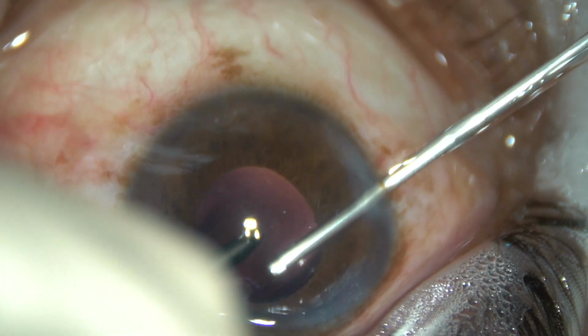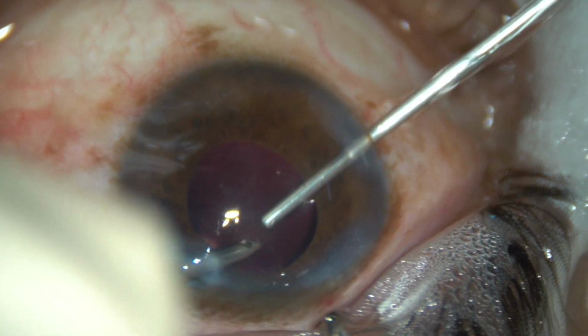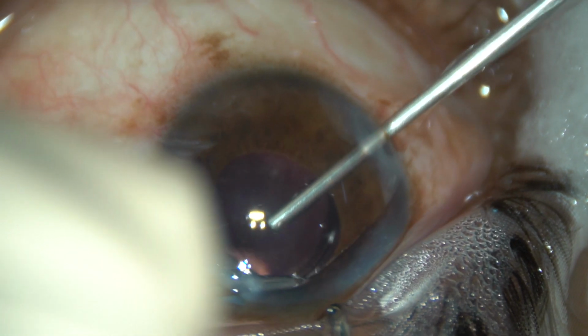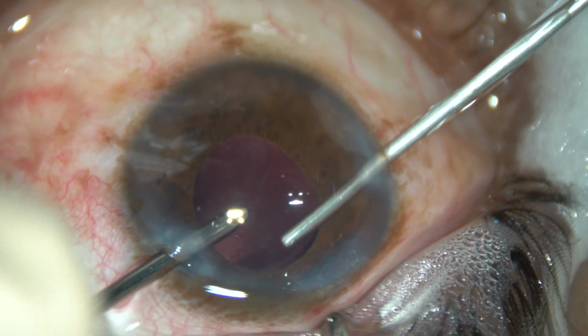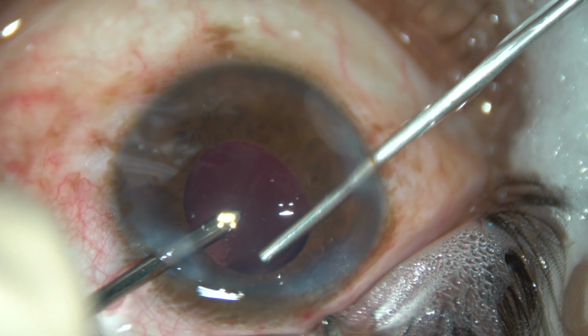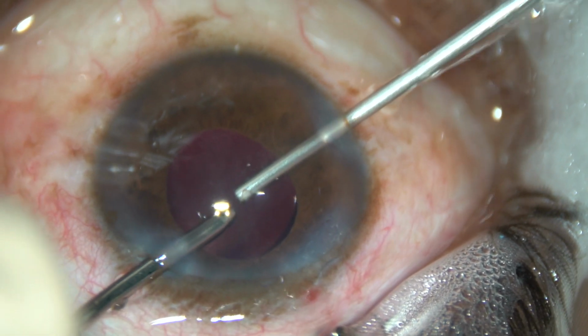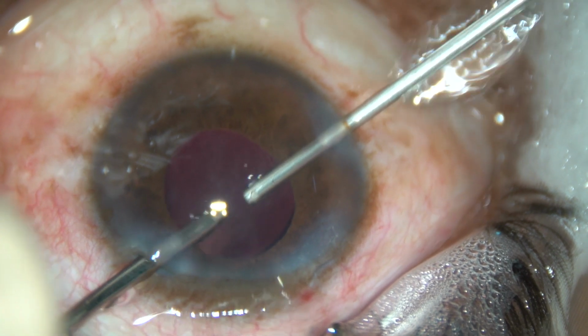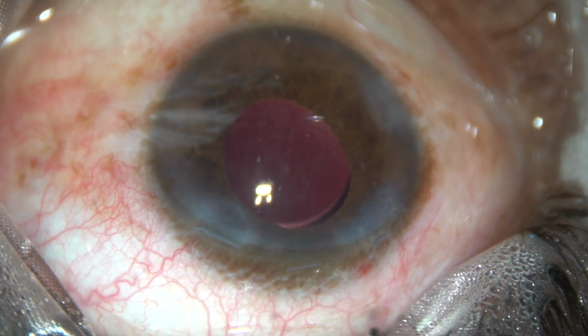Now, after applying pilocarpine, which has been edited out, I could see that there is some 1 or 2 strands, so there superiorly also. So I'm trimming that, making the anterior chamber free from vitreous strands.